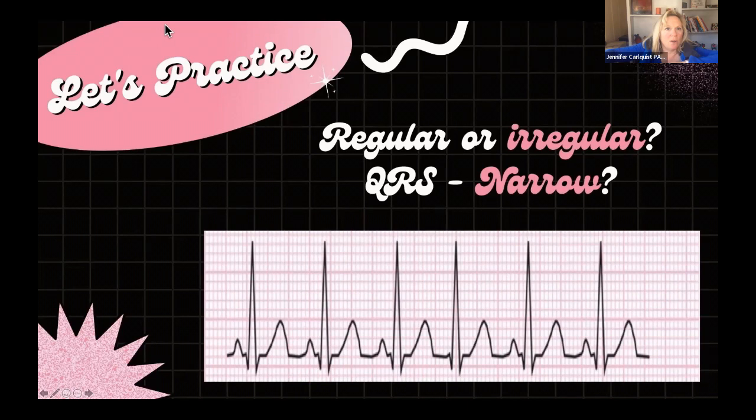Okay, what do we call this? Oh, okay. Yeah, this one's so tough. So Janice has dropped P wave. I like it. PAC question mark. Yeah, this is a toughie. So let's walk through it together. There's actually 3 types of ectopy. There's PAC, premature atrial contraction. There is PJC, premature junctional contraction. And there's PVC, which is premature ventricular contraction.